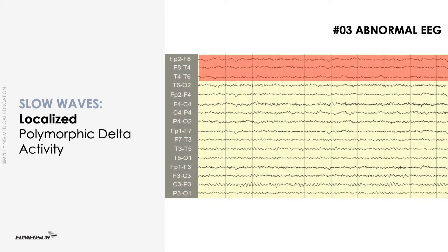While looking at EEG for localized slow waves, it is important to focus on the corresponding areas of both hemispheres. For example, in this picture, try to compare the first-second tracing of FP2F8 with FP1F7. The classic EEG sign of a focal disturbance in cerebral function is focal delta activity.